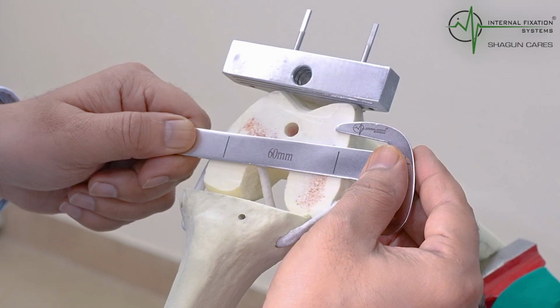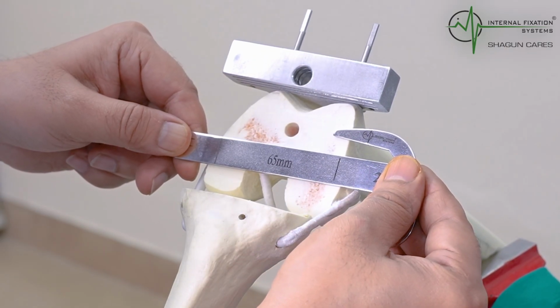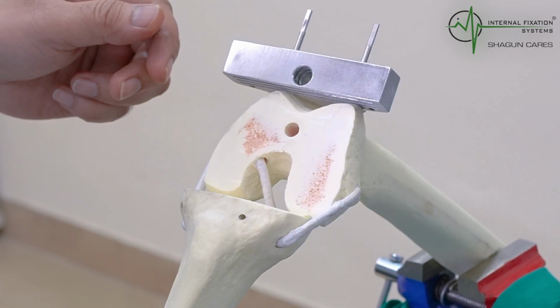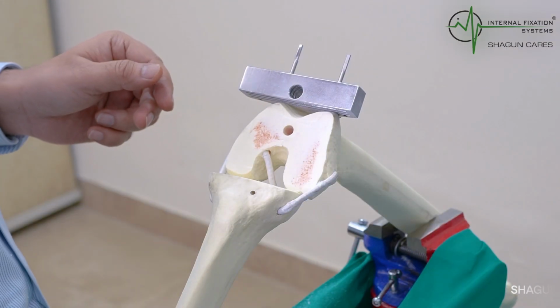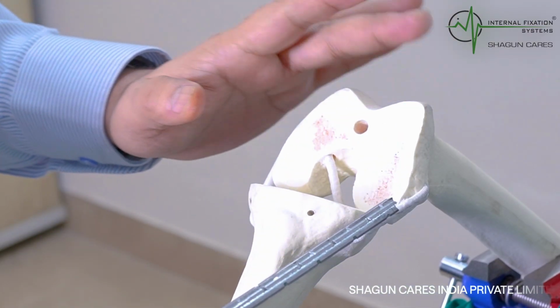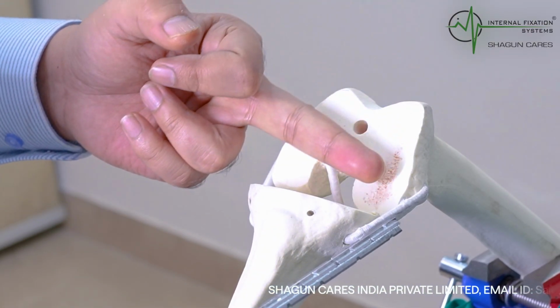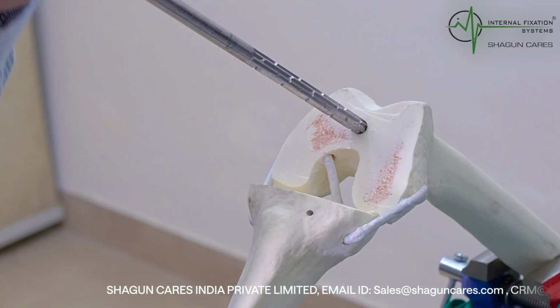So this is the 60. We can see the second one, 65. This looks fine. And now the 70. This looks big, it is going beyond. So let us try with the size of 65. Now we are going to do the reaming. We have removed this, proximal tibia cut taken, distal femur cut taken. Now we need to make the canal. So we are going to use this.